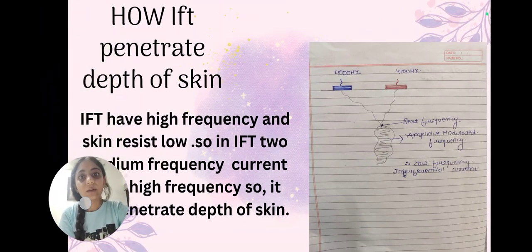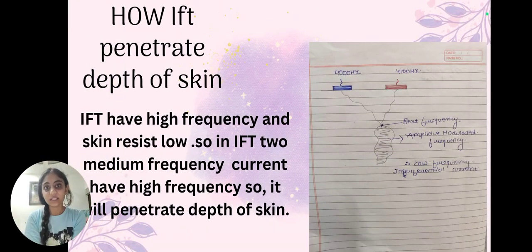Now we will see how IFT penetrates the depth of the skin. IFT has high frequency and the skin has low resistance to it. So in IFT, the two medium frequency currents have high frequency, so they will penetrate the depth of the skin.